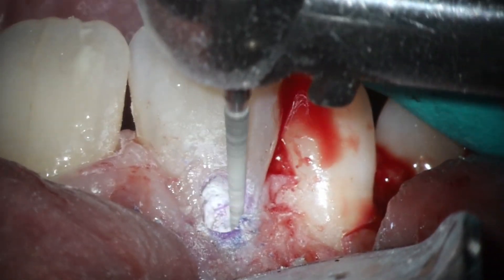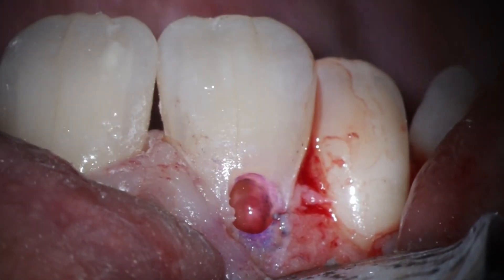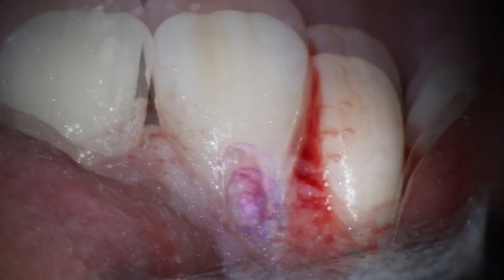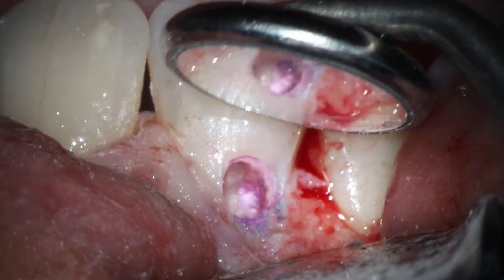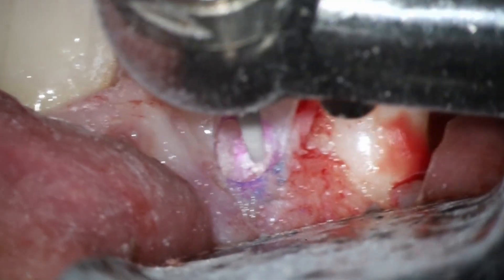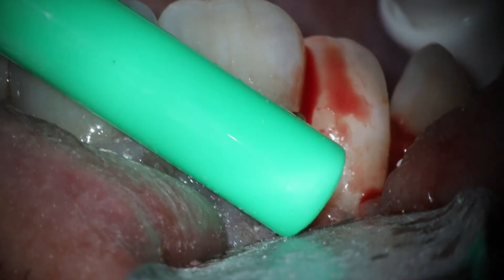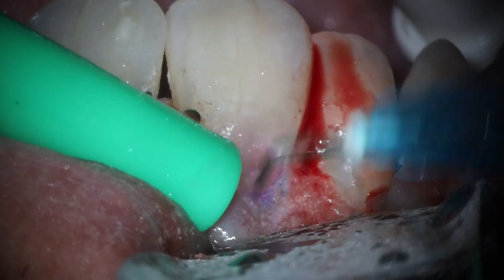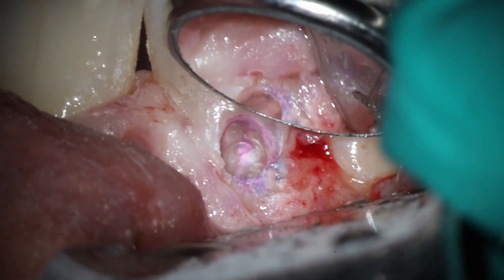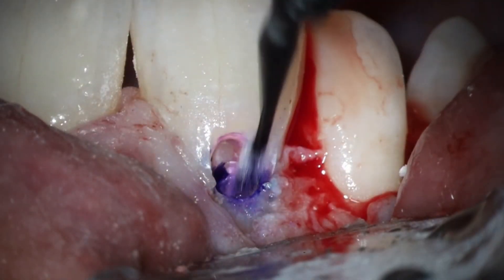Spoiler alert — the final X-ray I'm not super pleased with. It did not go down as far as I want. We'll talk about that when I get to the X-ray and what I think I could have done differently. The option was either kind of destroy the tooth, bone, and existing tooth structure to get it all out and make the X-ray look pretty, or find a nice compromise — I have really sound enamel there. I'm not worried about other areas penetrating through, because you can see on the cone beam the point at which the resorption entered the tooth is super crestal. So what I've done is not touch any of the bone here. I want to leave it healthy where it is. You can see there's still a nice ring of enamel, even though it is very skinny in there.